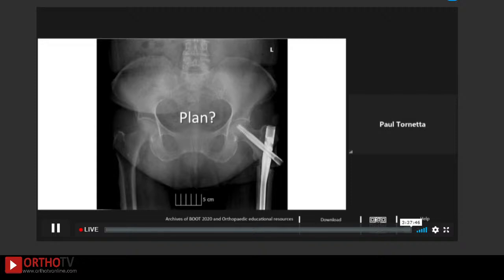Then I would use one of the newer locked plates rather than a blade, I think, for this. But one of those two options, and then really compress it on the lateral side. Just compress it until that screw is about to fall out. And before you do that, you've got to loosen up the screws on one side of the plate. And then I may replace those anterior plate screws at an angle or just take them off, depending on the fixation. I would probably add some sort of rhBMP-2 or something with graft to what will be an anterior defect after you burr it out.